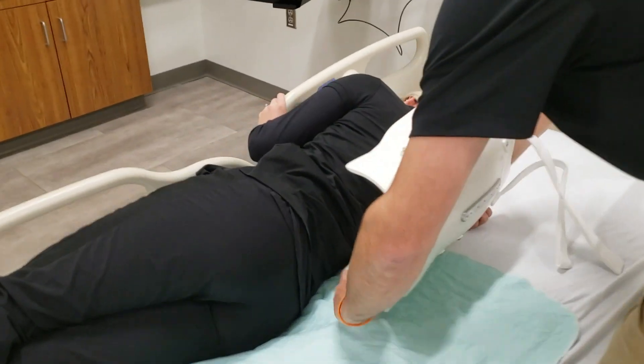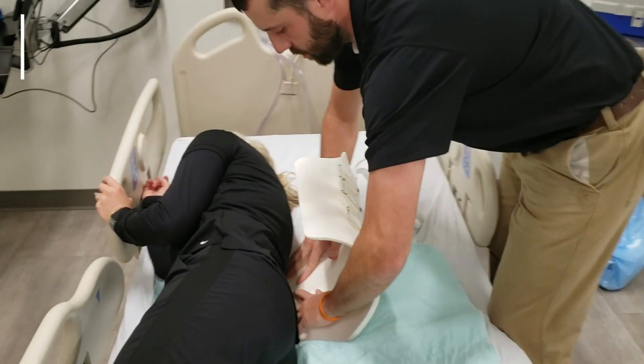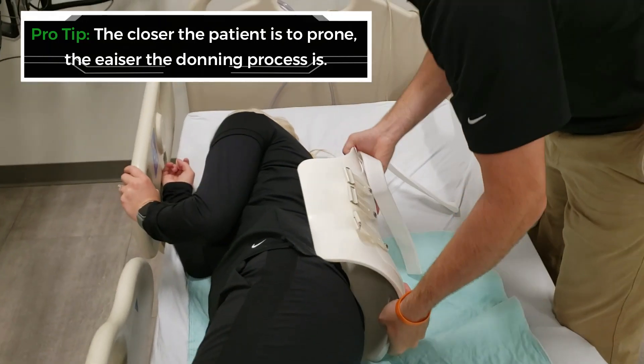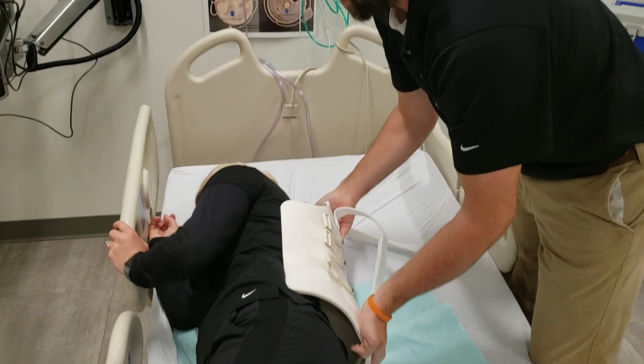Once on their side, you will line this up with the groove in the hip. You'll push down and slide underneath. Then have them roll back into it.